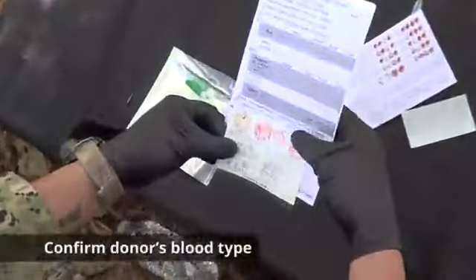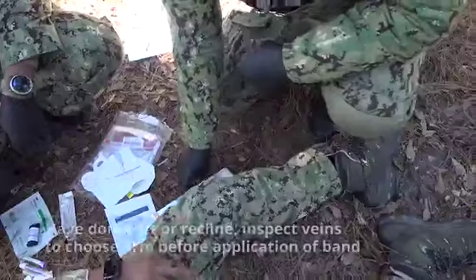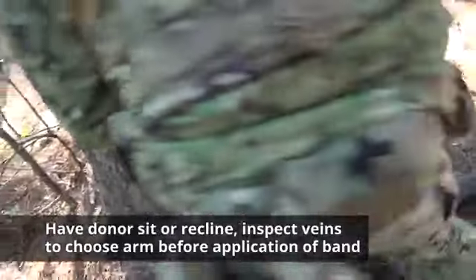Confirm the donor's blood type. If not previously documented in a unit blood program, use an Eldon card to determine the donor's blood type. Now have the donor sit or recline and inspect the veins to choose the arm before application of the band if possible.